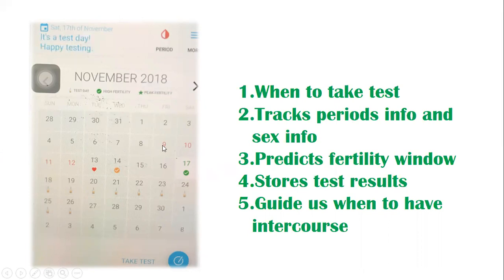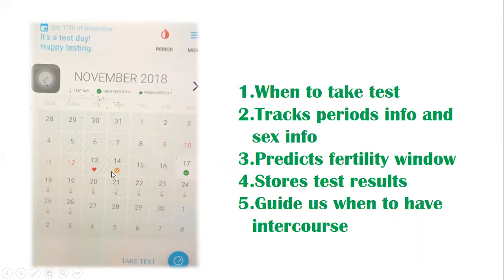First, we need to calculate the periods and enter that information. Based on the information we provide, we'll get the results. For example, there's an icon on the 17th, and in the coming weeks we will record intercourse data. Based on all the information we give, the app will predict the fertility window.